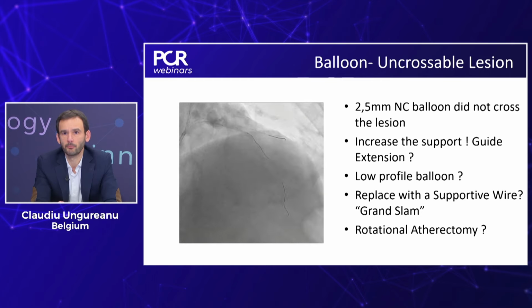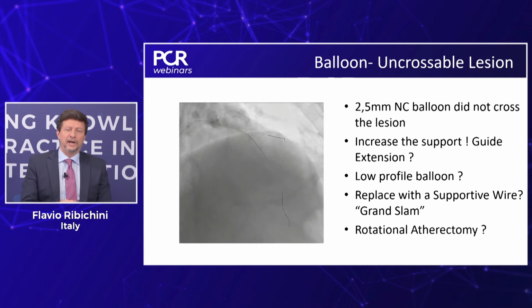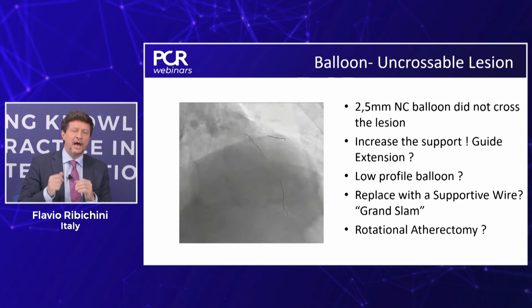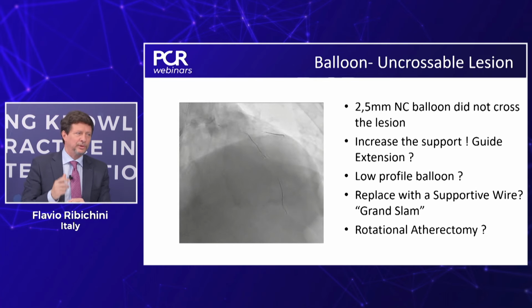And we need to discuss that before proceeding so easily with high-risk strategies like rotational in a left main, heavily calcified and diffuse disease. You are right, but I tell you, anything you do without a good lesion preparation with something like rotational atherectomy, putting supportive wires, putting extension catheter, will ask you to push. You know, our work is delicate. The more strength you use, the more complications you have.